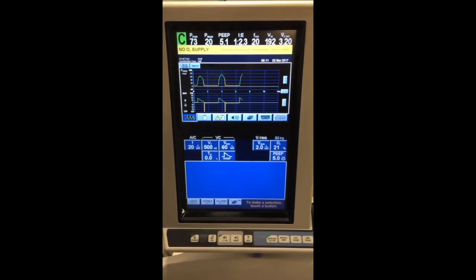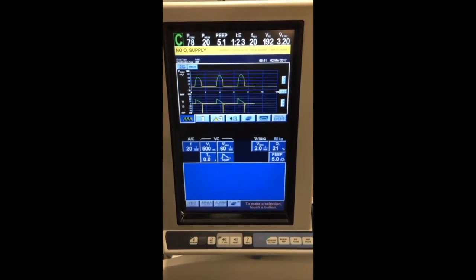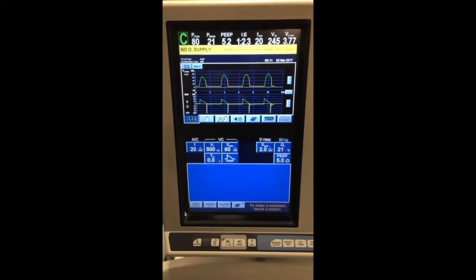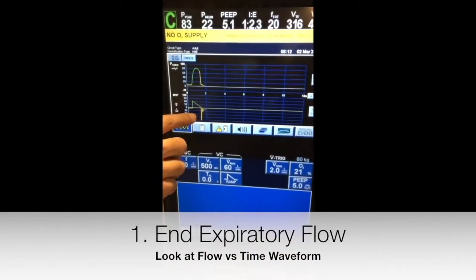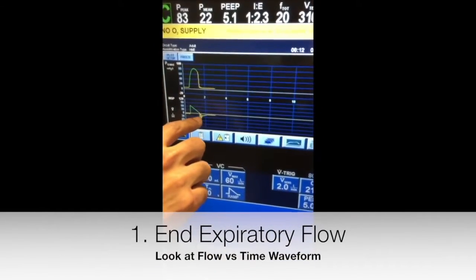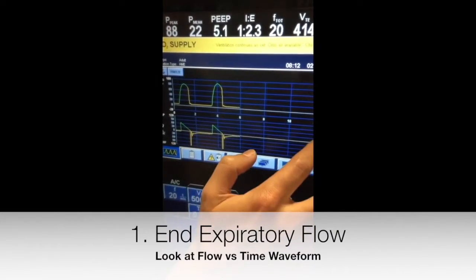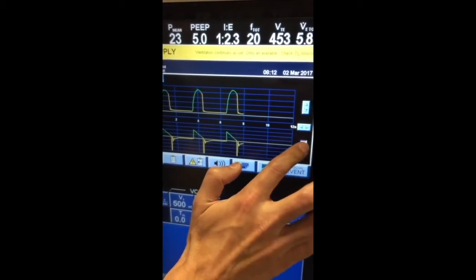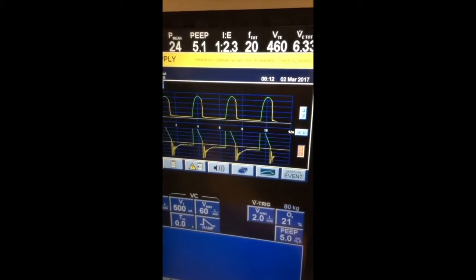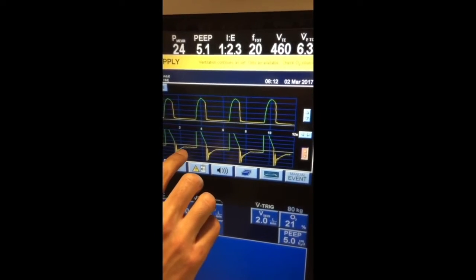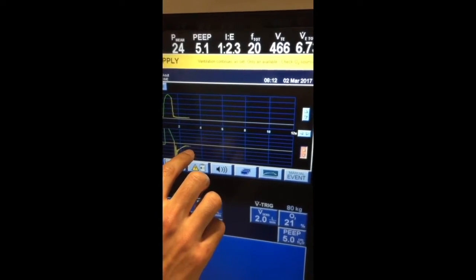In a patient with obstructive lung disease, when you're trying to figure out if they're potentially auto-peeping, there are three ways to do this. The first is by looking at the flow versus time and trying to see if the expiratory flow actually reaches zero. Sometimes it's hard to see unless you magnify it, so it's worthwhile magnifying the flow curve to see if there's actually flow reaching zero by the time the next breath gets triggered.